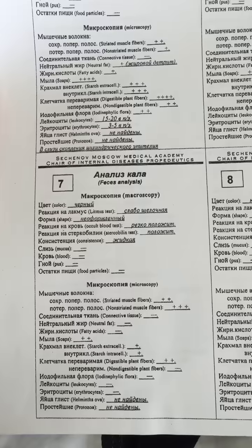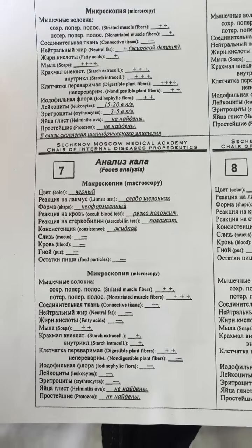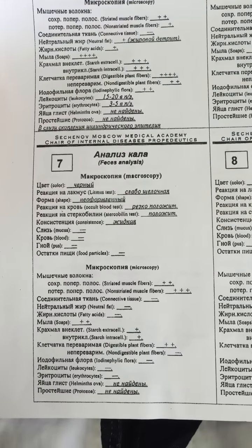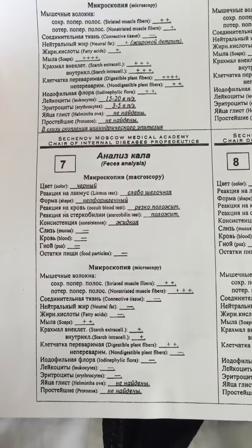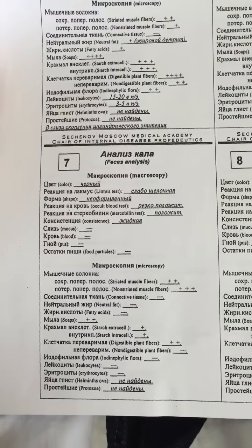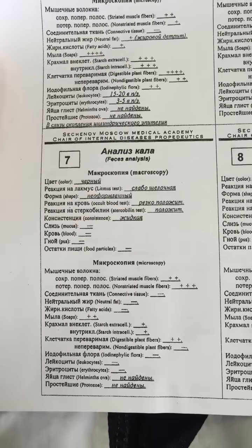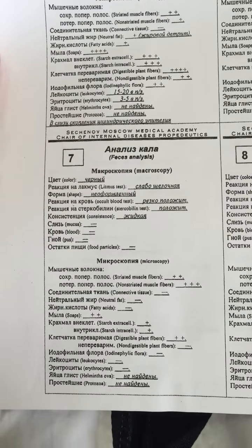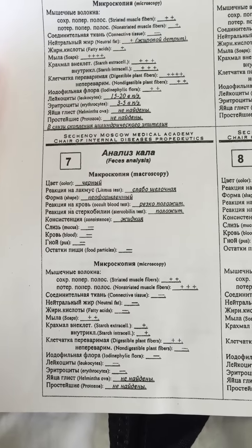Yes. The number 7, I saw very often such analysis on today's exam. The color is black, yes. The litmus test slightly alkaline, non-formed, it means diarrhea. Occult blood test, sharp positive, yes. Stercobilin normal. The consistency is also fluid, the diarrhea with black feces.